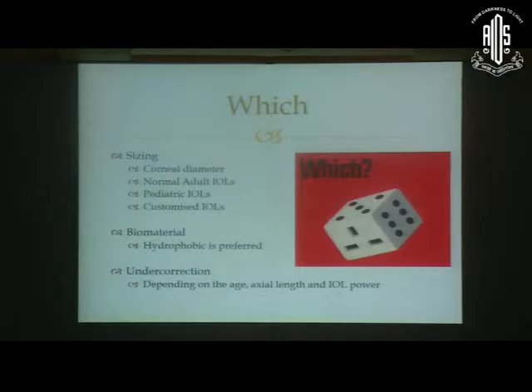Which IOL to put? Sizing is important. You can put a normal adult IOL, or you can put a pediatric IOL.